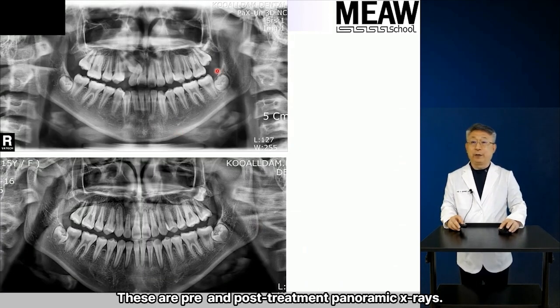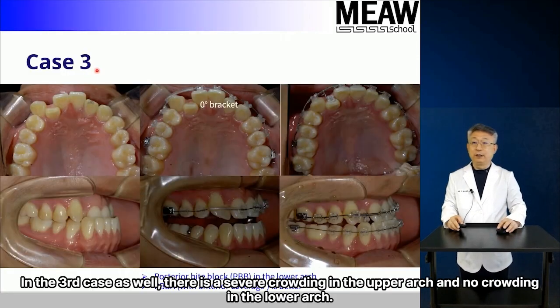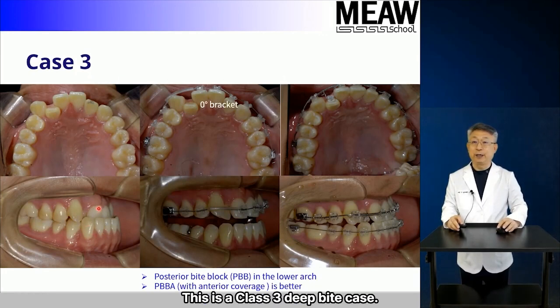These are pre- and post-treatment panoramic X-rays. Despite orthodontic traction of the upper canine, the roots of adjacent teeth are in good conditions after the treatment. In the third case as well, there is a severe crowding in the upper arch and no crowding in the lower arch. This is a Class 3 deep bite case.